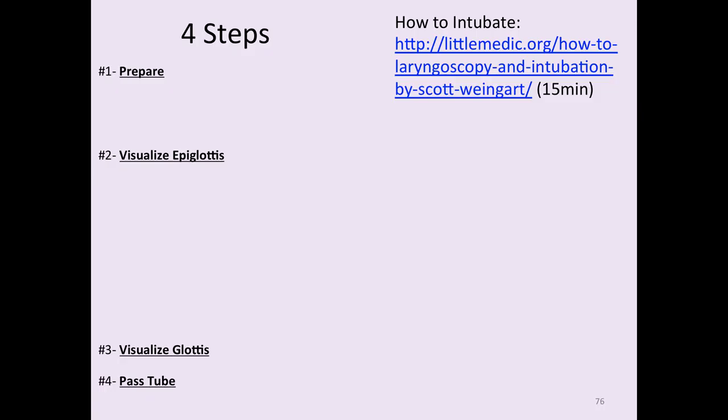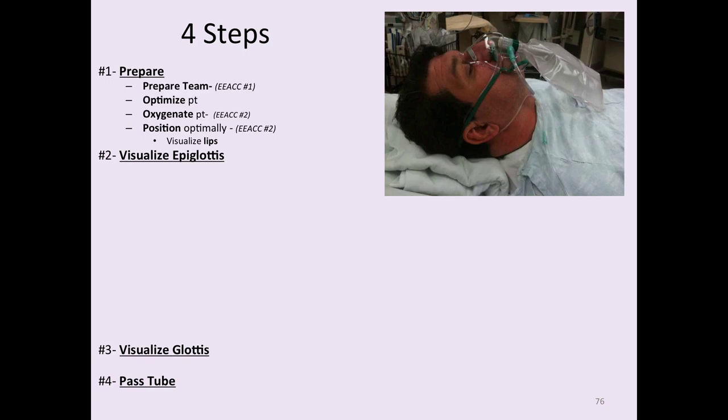So remember, 4 steps. We've already sort of gone over how to prepare the patient, right? We've oxygenated them, we've optimized them, and we've positioned them, and we've identified already our key anatomy. There's some lips there.